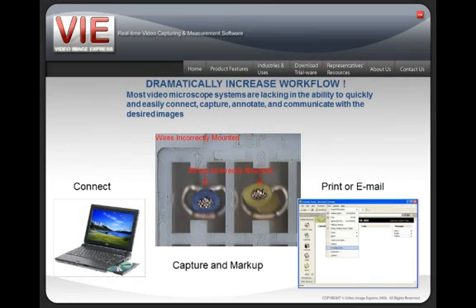Video Image Express allows you to dramatically increase workflow. Most video microscopes are lacking in the ability to quickly and easily connect, capture, annotate, and communicate.